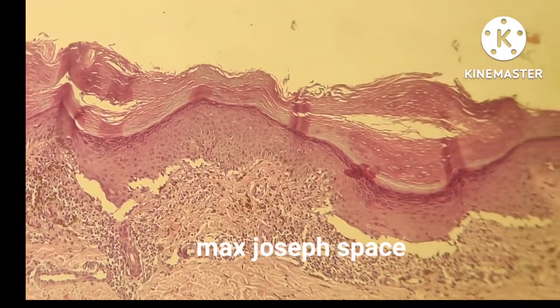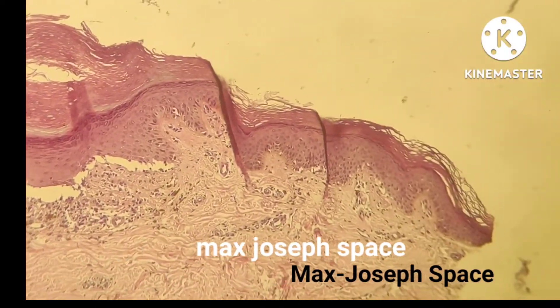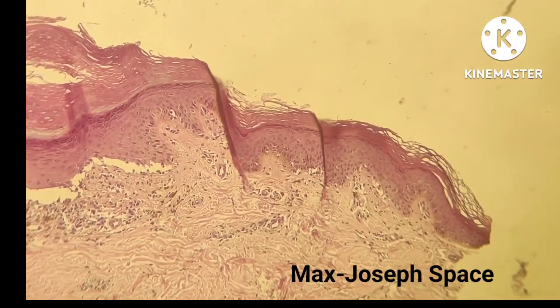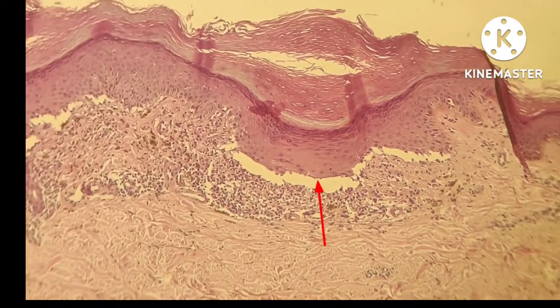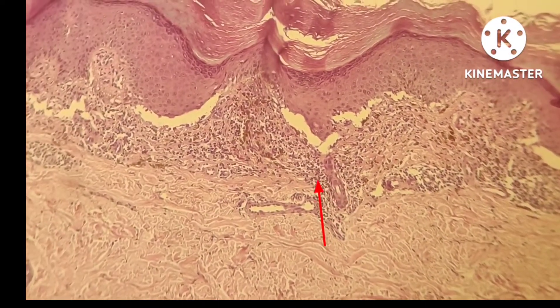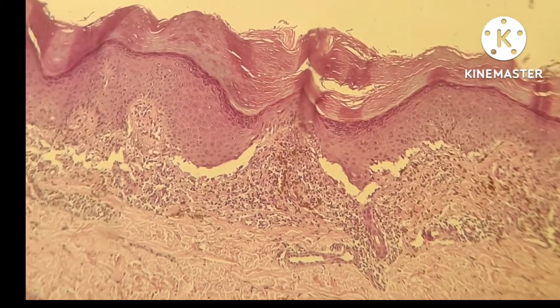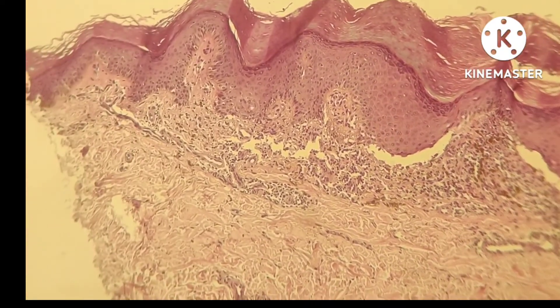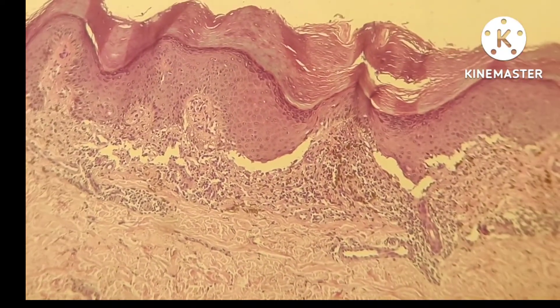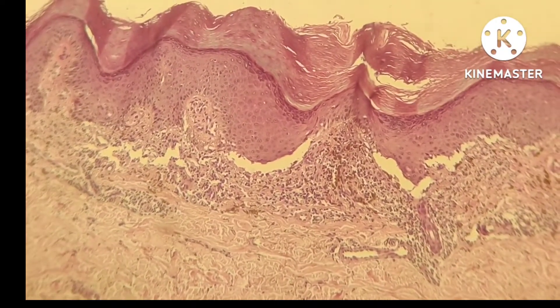This biopsy shows a very prominent Max-Joseph space — we say artifactual separation between epidermis and dermis. Many times if it is formed in vivo, it forms the vesicular type of lichen planus. These vesicles develop due to extensive damage to the basal cells.